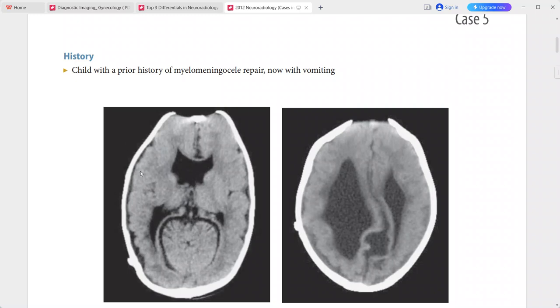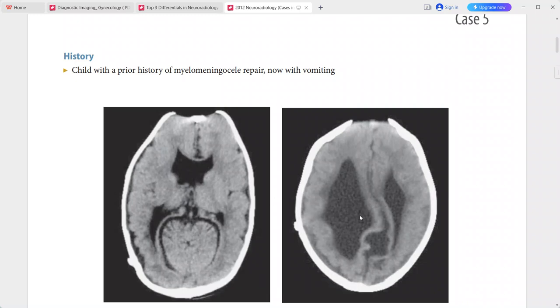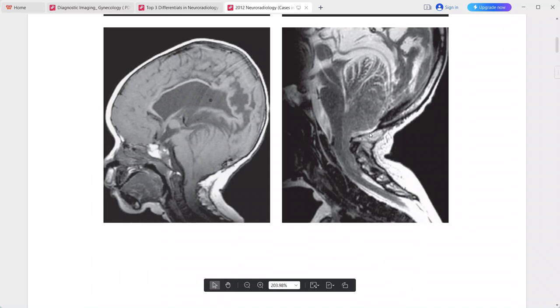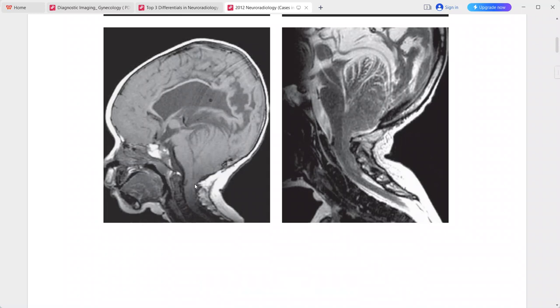There is a deficient falx cerebri, narrow gyri with shallow sulci posteriorly. On sagittal MRI, there is a low-lying torcula herophili with a small posterior fossa, and downward displacement of the cerebellum into the upper cervical canal.